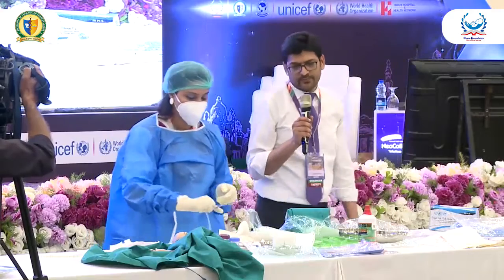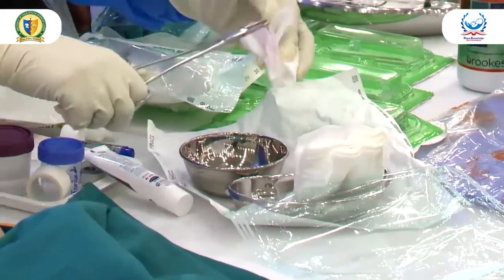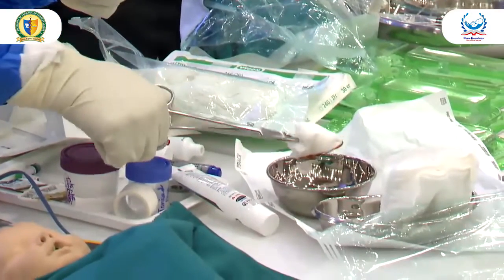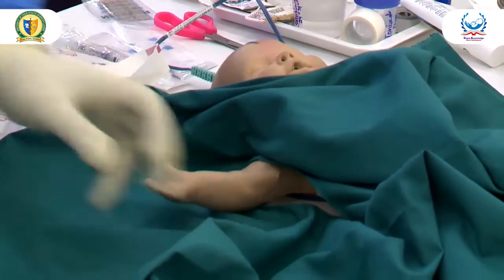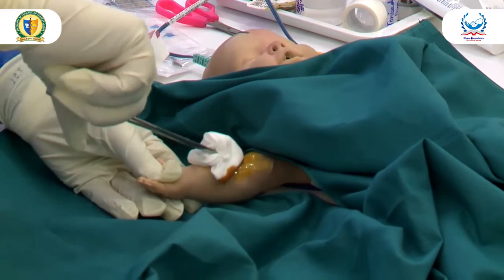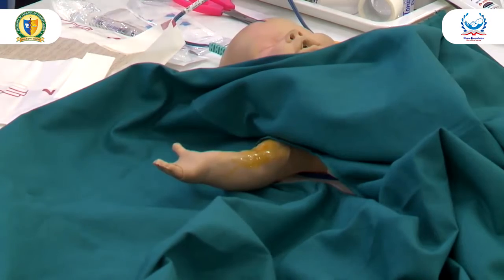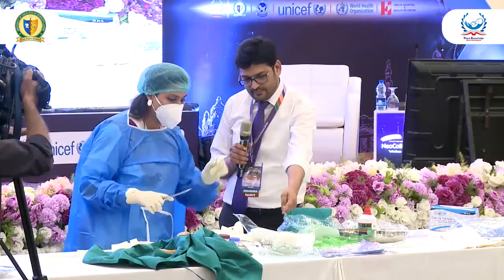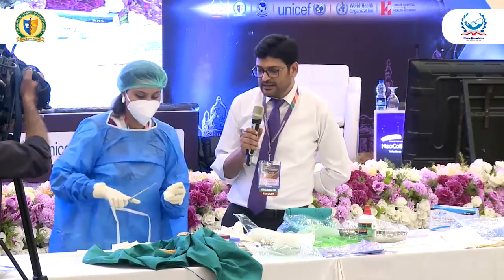We'll hold the gauze piece with the sponge holding forceps, and then dip it in a little bit of povidone iodine and clean the site of insertion from center to outwards. Now we are about to clean that applied povidone iodine.